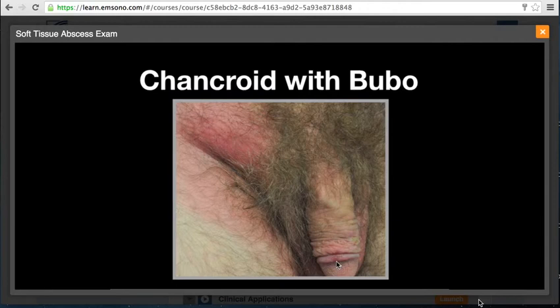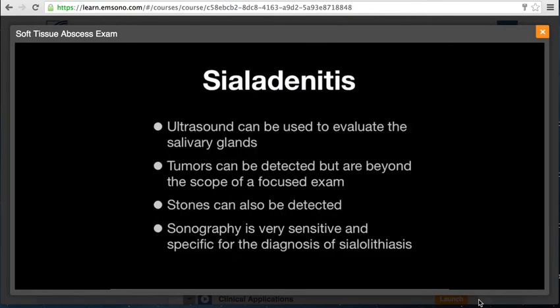It turns out, in further talking to this patient, and history is always a good thing, this patient stated that about 2 weeks ago he had this ulcer on his penis, but that went away on its own, and that's not why he was here. He was here just because of the swelling here. Turns out that this patient ended up having chancroid, and this was a bubo here. So this was basically a necrotic node here, and this was not something that you would want to do an incision and drainage on.